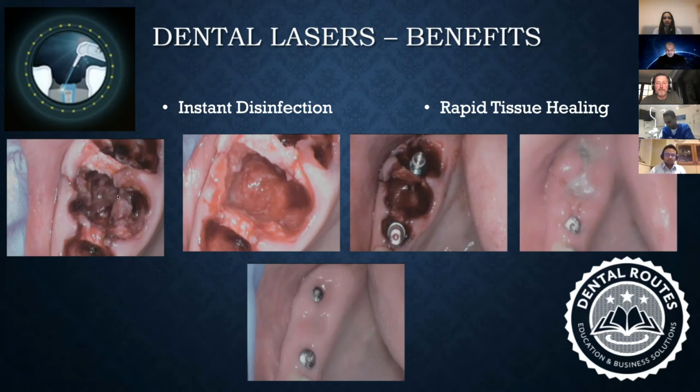If this patient had come to me before I had started using dental lasers, my protocol would have been: I would have taken those teeth out, cleaned up all the socket, left that patient for 3 to 4 months, got the patient back again, and seen how the healing is, how much bone loss has happened vertically and horizontally. At that stage, I would see if I need to do a sinus lift, or could I get away without a sinus lift? Is there enough vertical height, and so on and so forth?